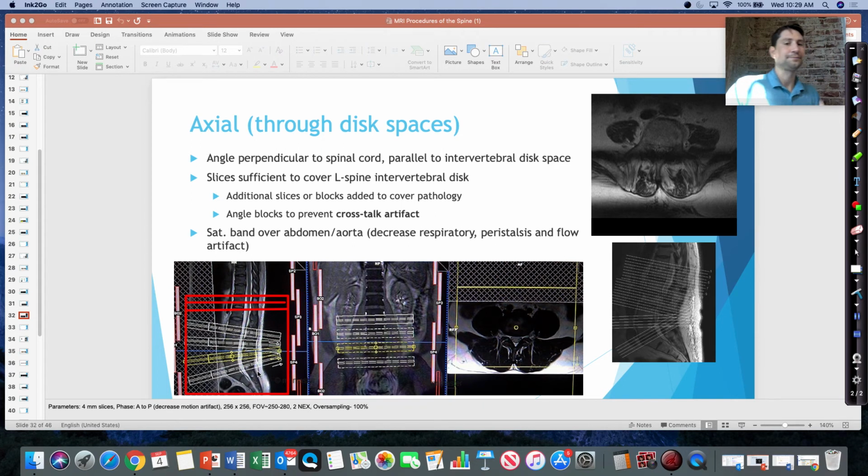I've noticed they want me to do like a stack on like the very last one, like L5 S1. Yeah, and that's what it is, because they just basically want to cover this area up here where you don't have much variation, and then just see how L5S1 is completely turned, and that's why. And also it's good too to get a little bit more of that sacrum just in case you have sciatic nerve issues.